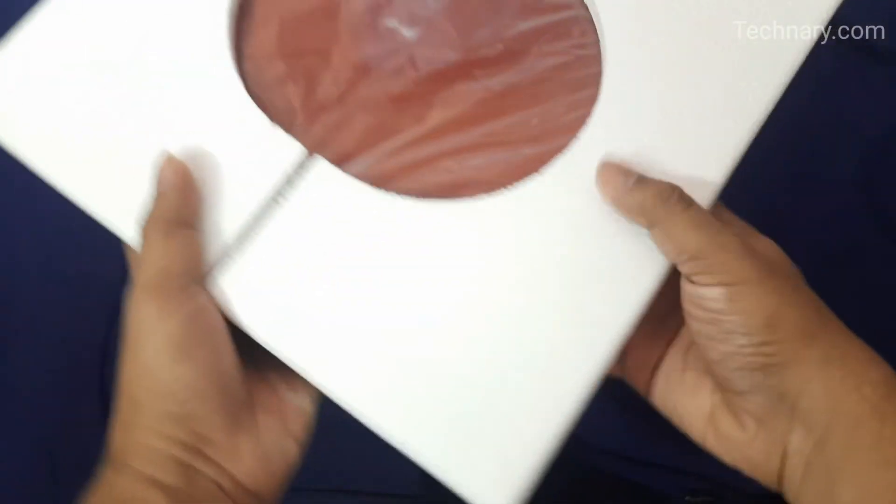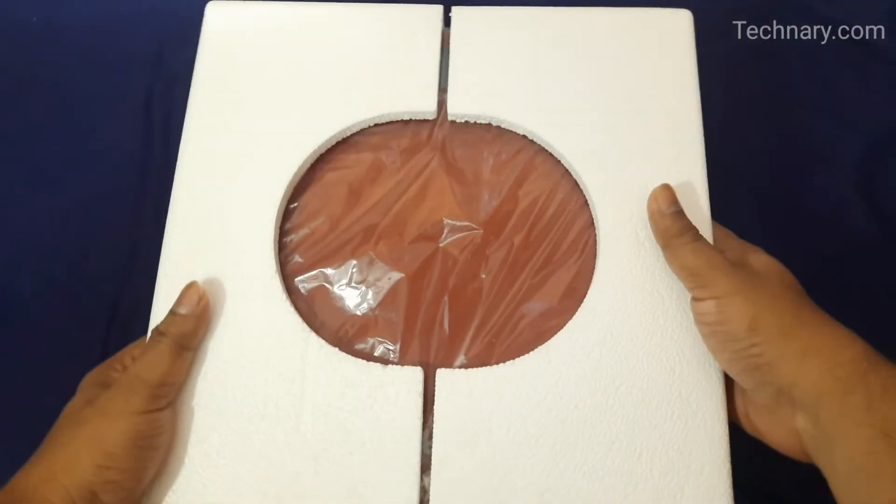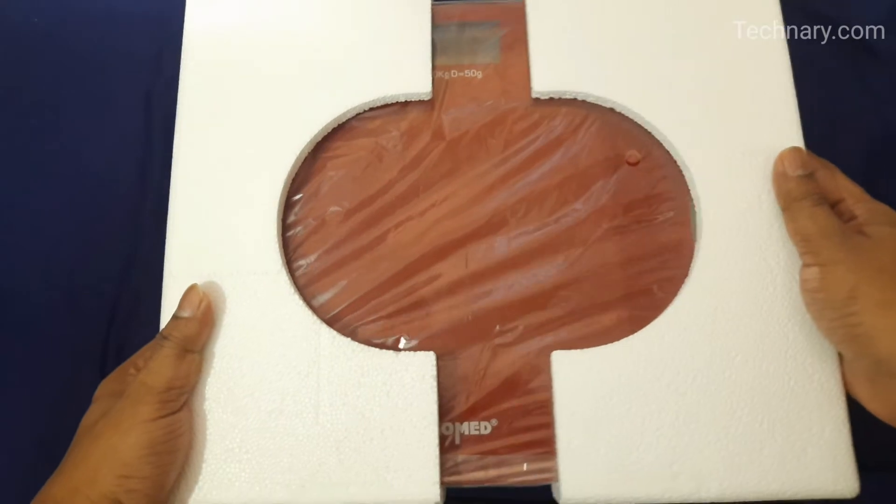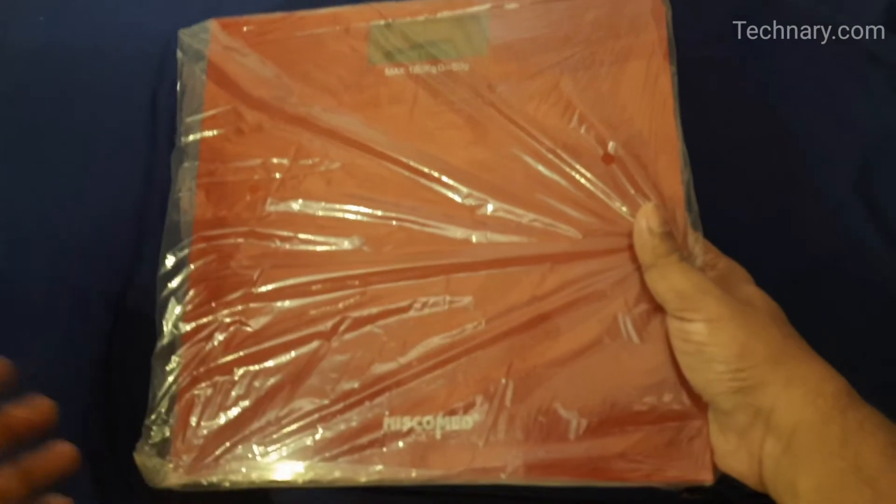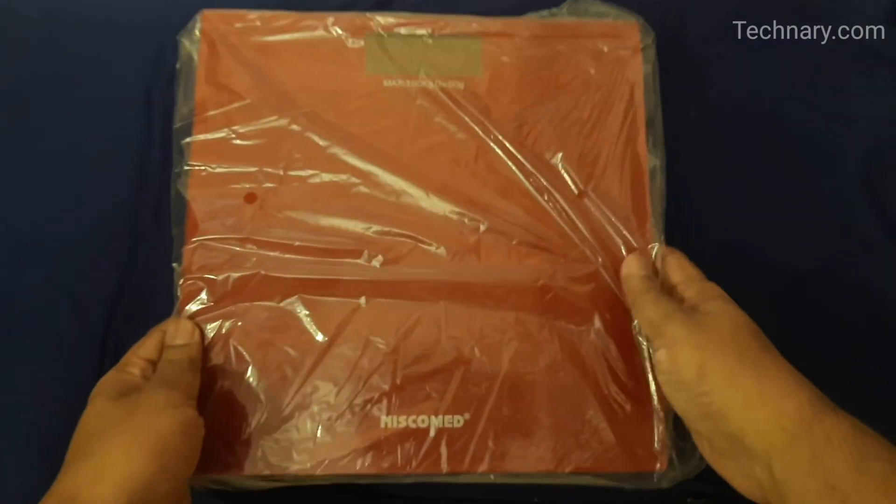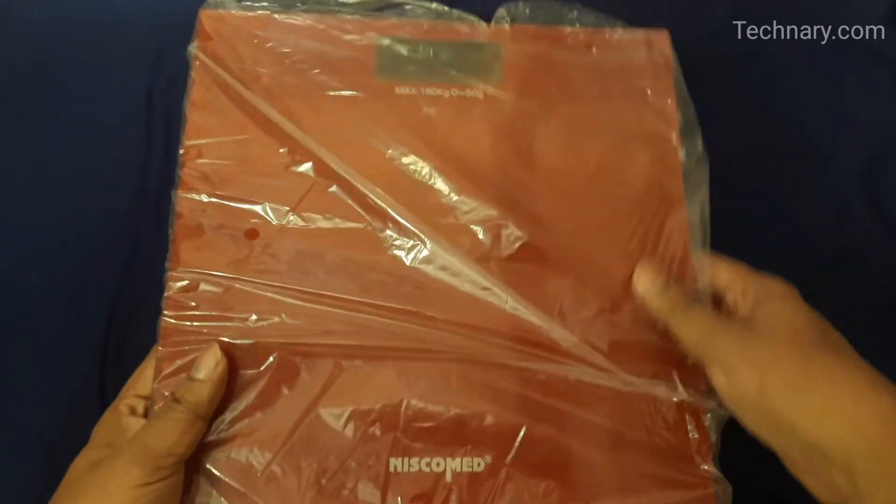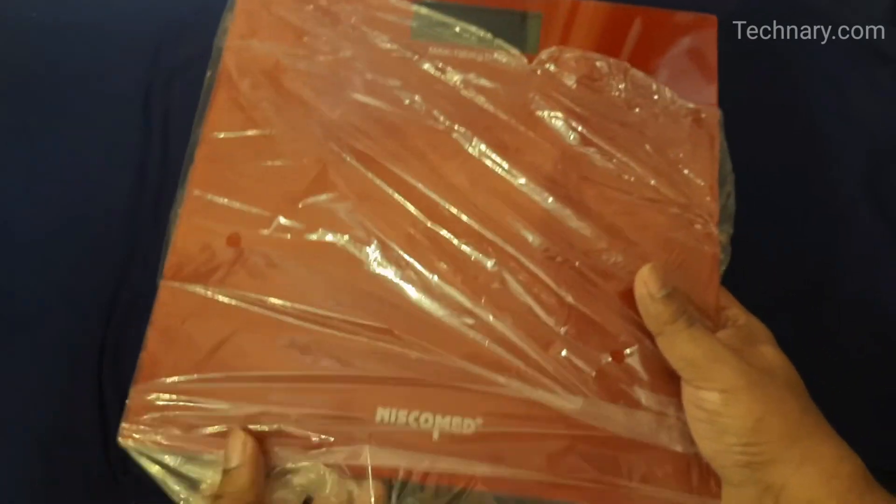This is the product itself which is the personal digital scale. This body scale is equipped with a high precise strain gauge sensor system, tempered safety glass platform and the capacity is 180 kg that is 396 LB or 25 stone.